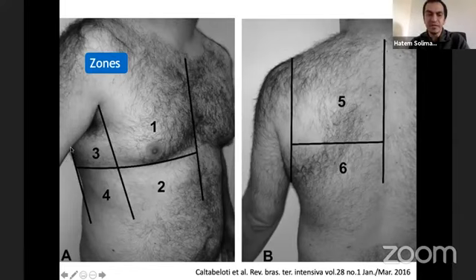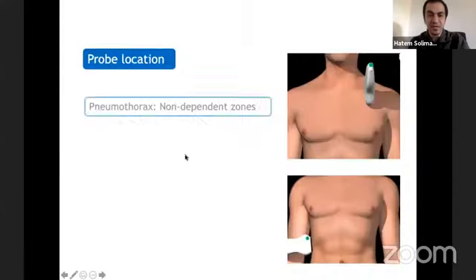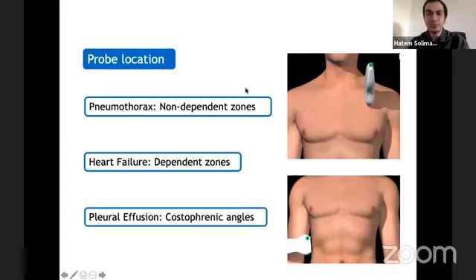posterior to, or behind, the posterior axillary line to get the lowest part. And as we always say, the devil always hides in the backside. So you have to try to get as posterior as you can when you scan the lungs. The horizontal imaginary line here is almost the nipple line. And the location of your probe depends on what you are looking at.